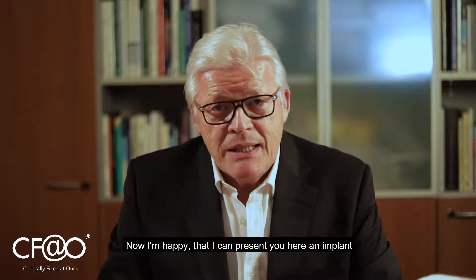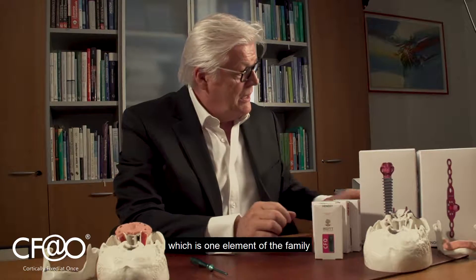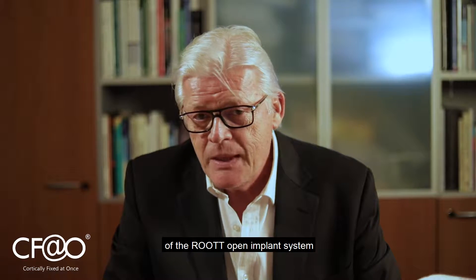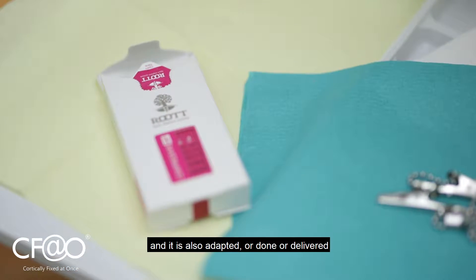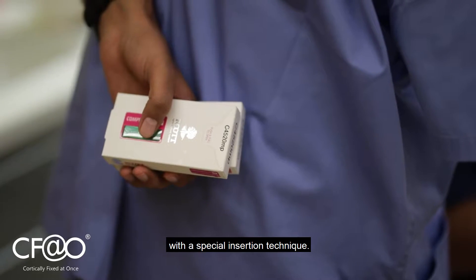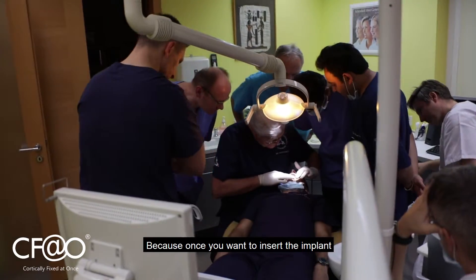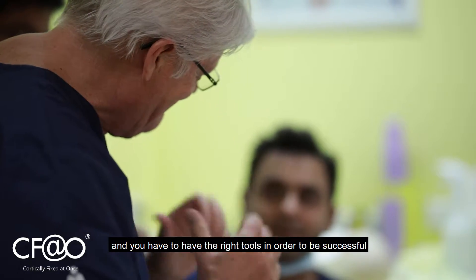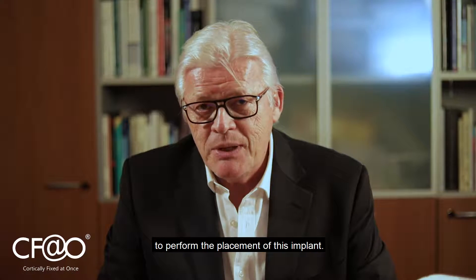I am happy that I can present you here an implant — this one — which is one element of the family of the ROOTT open implant system. It is also delivered with a special insertion technique, and the technique is a very soft one. Once you want to insert the implant, you must first know your anatomy and have the right tools in order to successfully perform the placement of this implant.